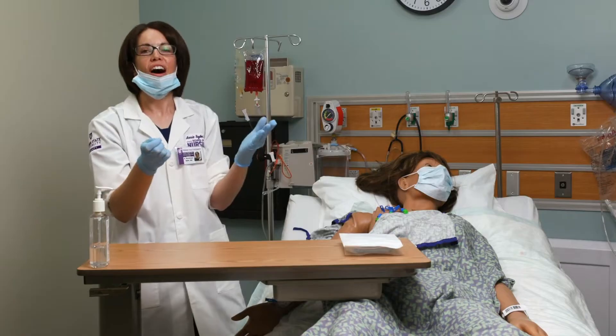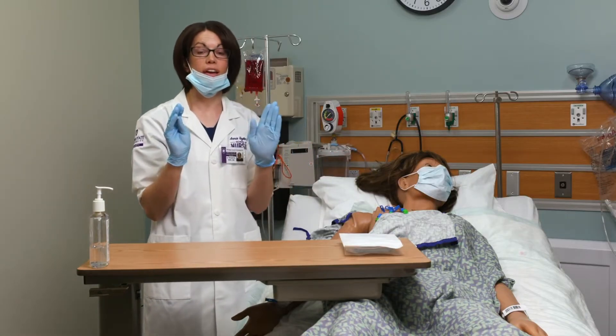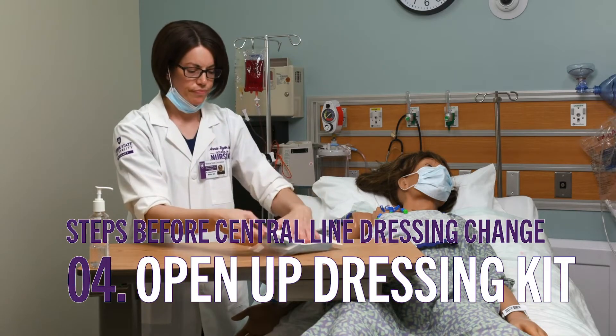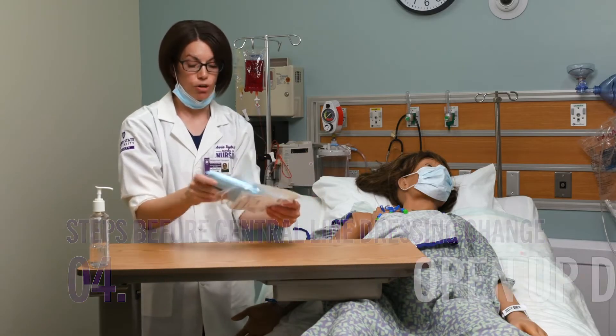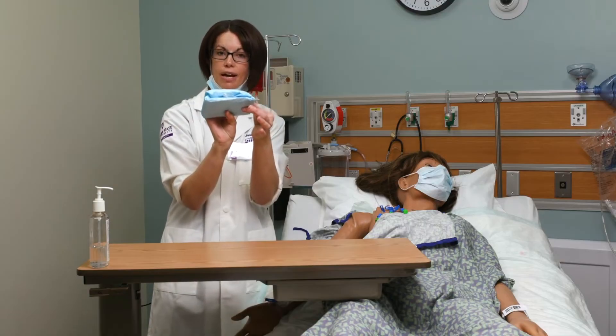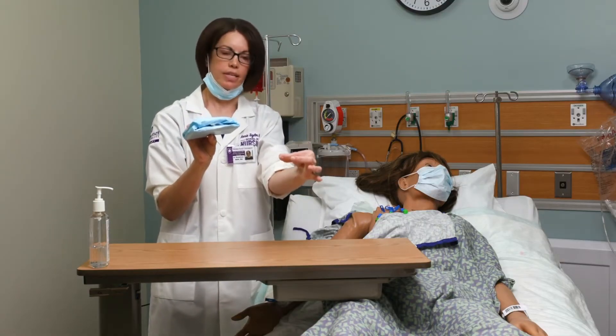I've got the old dressing off, inspected the site, and confirmed it looks good. Now I'm going to remove my gloves and open up my kit. This is going to be a sterile procedure. When I open it there's a little tab, and I want to pull that tab away from me.